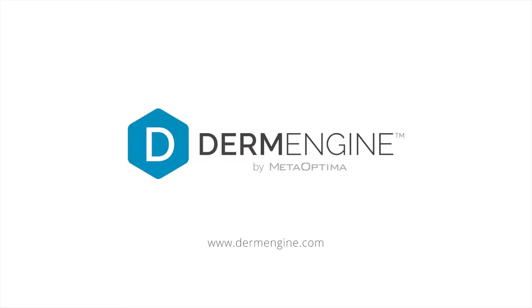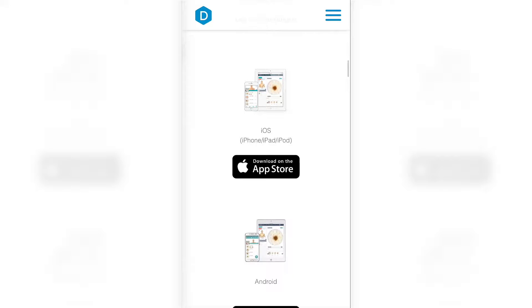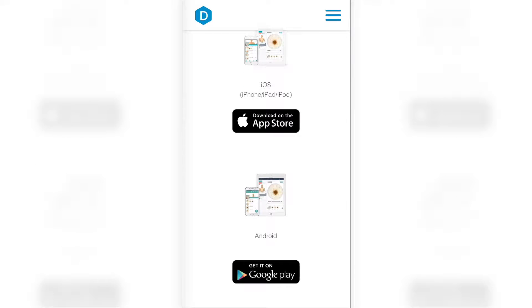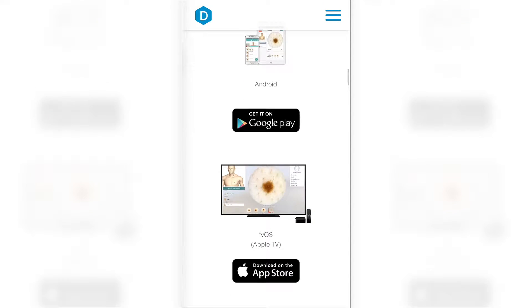To begin using DermEngine on your smartphone or tablet, you can download the app through the App Store or Google Play. You can also easily find the links on the DermEngine homepage.